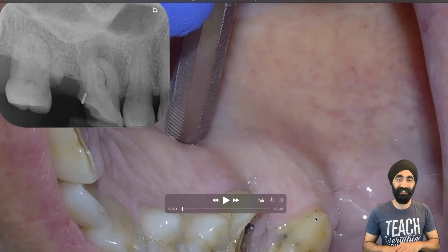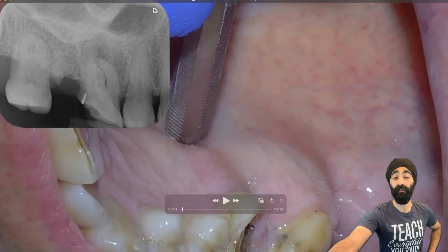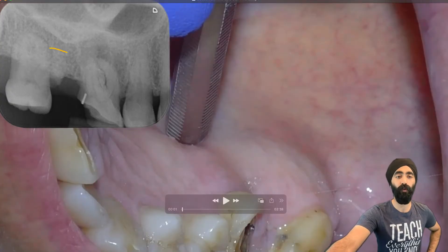Hello, I'm Jaz Galati. In this video, I'm going to show you how I extracted this upper right first molar and the root of a second molar, you can see right there.